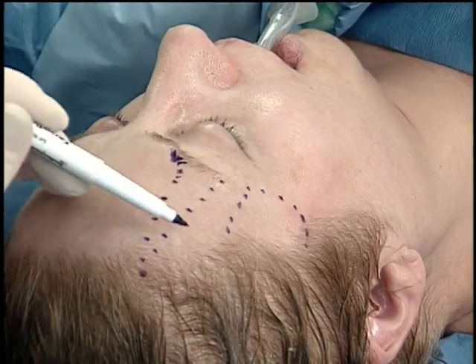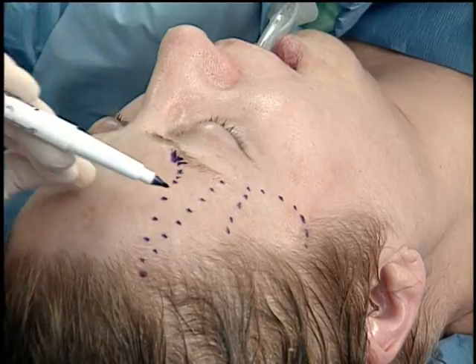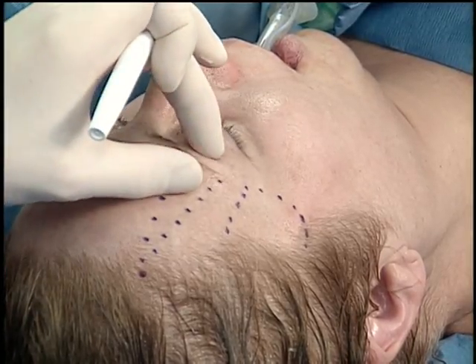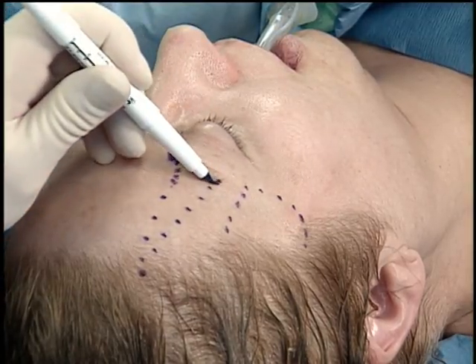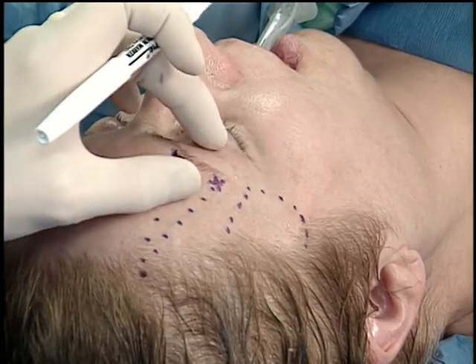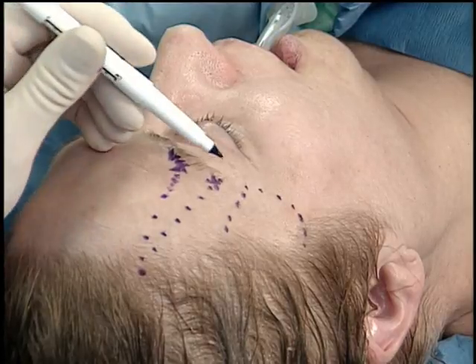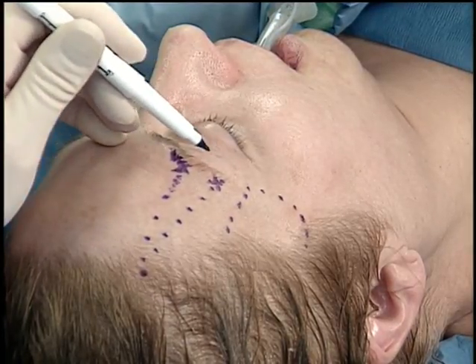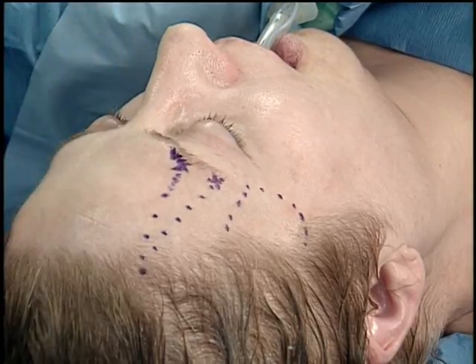And so we're very safe, both for our dissection with our sharp point dissector and the passage of the contour articulus thread. I exit on the other side, the superior side of the brow, just above the hairline. X marks the spot. The reason I do that is there is a nice fibrofatty roll in the brow that mitigates inferior descent of the contour thread, and when you go below there you'll get some threads that poke out through the thin upper lid skin, so I stay above that fibrofatty roll.